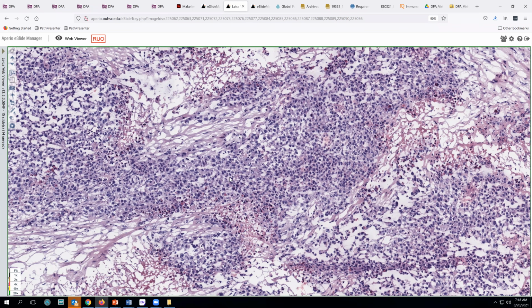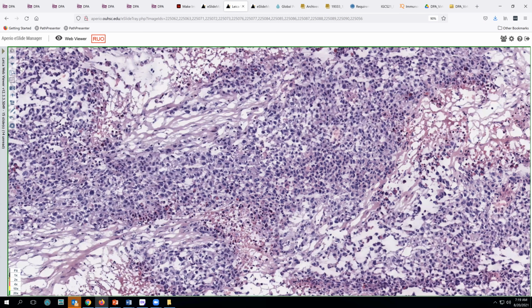It does not look like a common epithelial carcinoma. It's obviously not a borderline tumor, which can also occur in this age group. So by providing the surgeon with that kind of a differential, that helps them to guide further therapy and management intraoperatively. Because of the possibility of germ cell tumor, peritoneal staging and sampling to exclude occult disease was important.